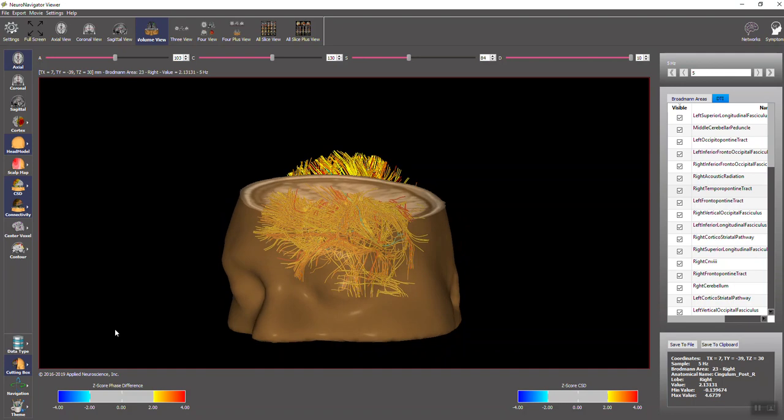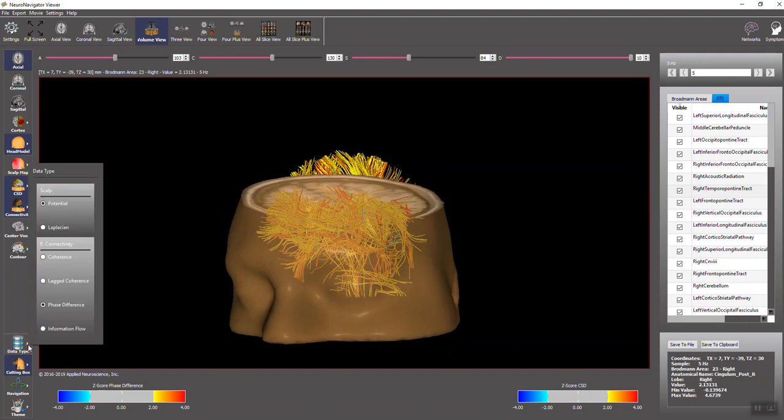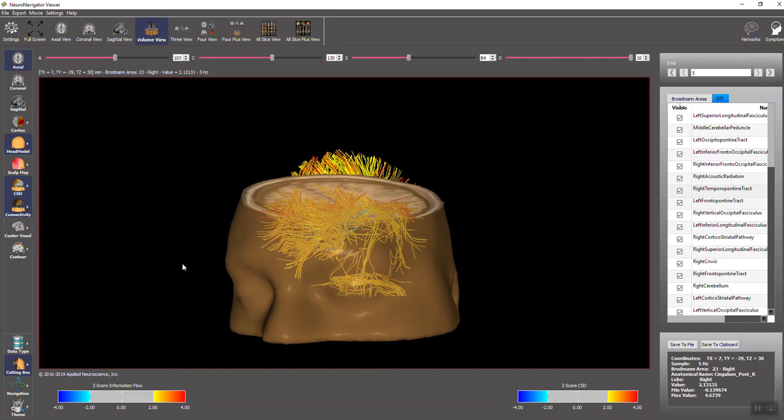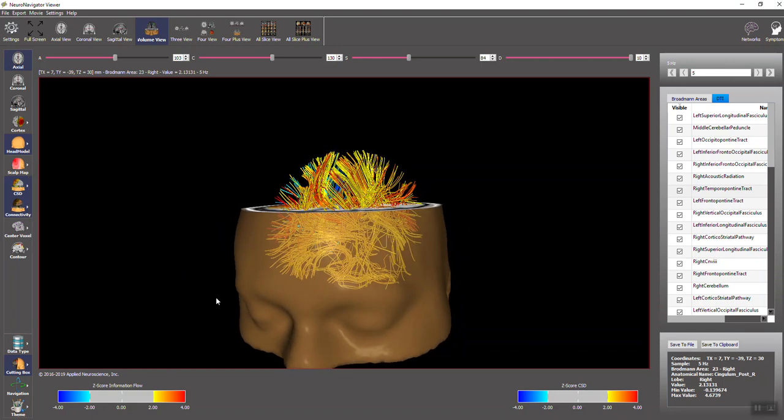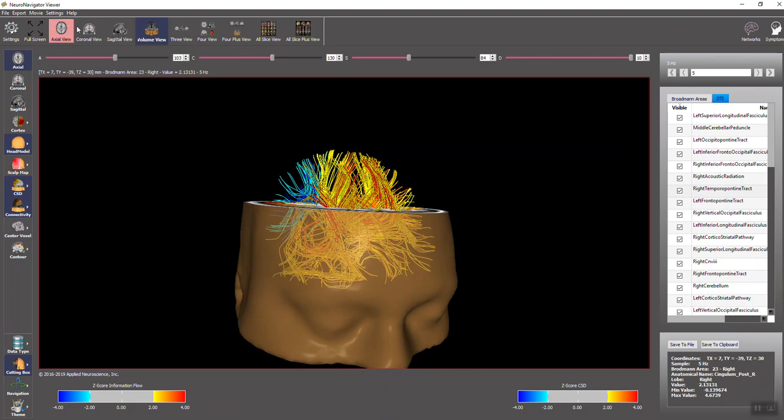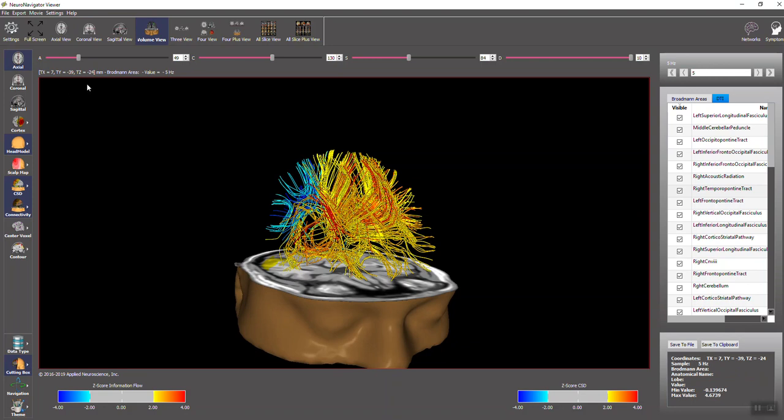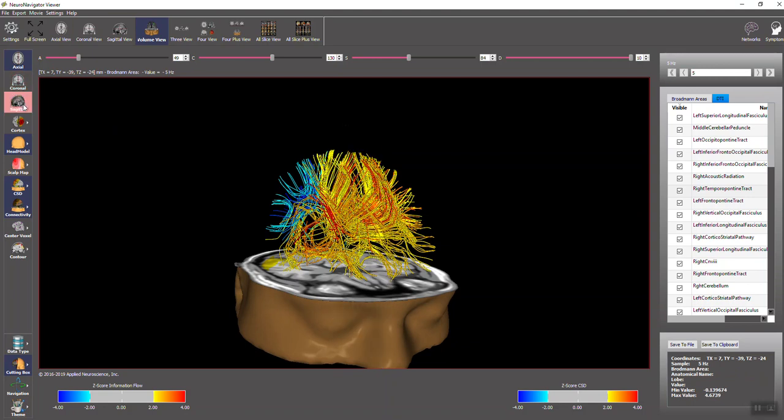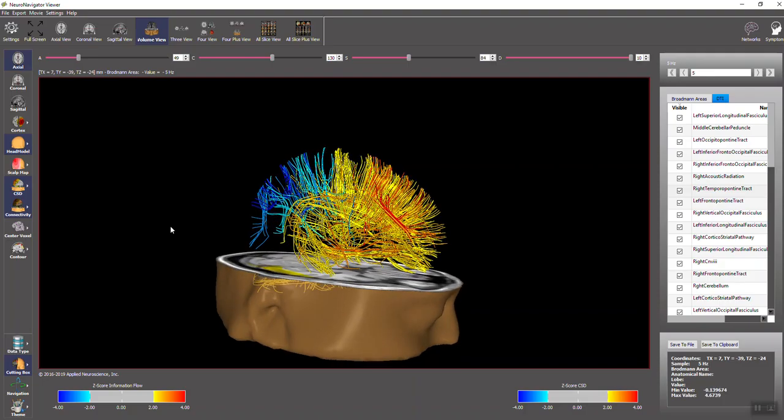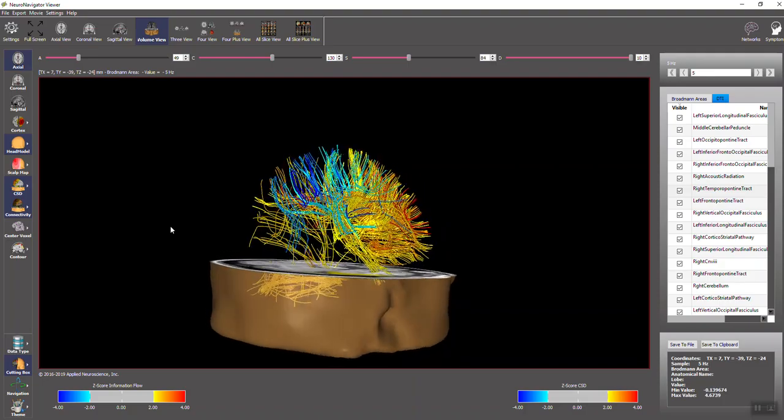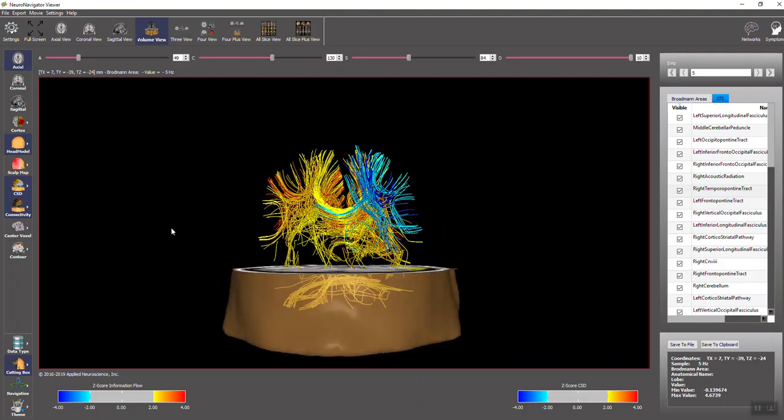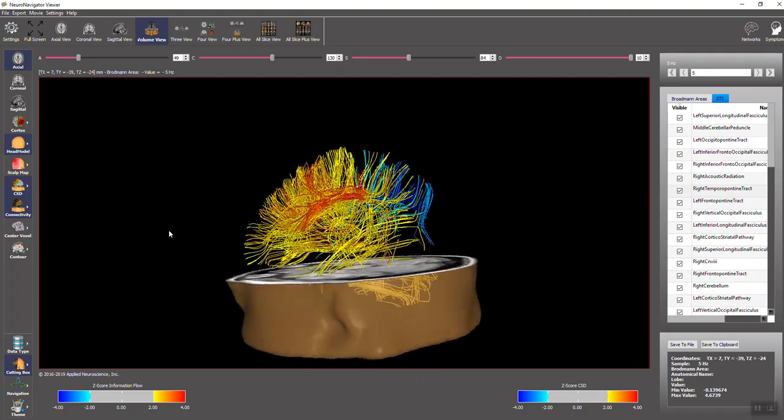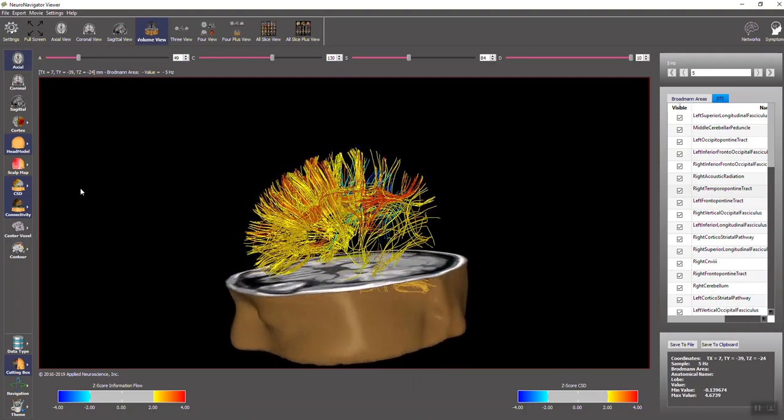And we can also look at information flow using the phase slope index. And there's the Z-scores for information flow, now superimposed upon the diffusion tensor imaging fiber bundles. You can change the axial and you can add coronal and sagittal slices. And it's nice to have those as navigation points to look at the different fiber bundles that are deviant from normal based upon the Z-scores from our normative database.